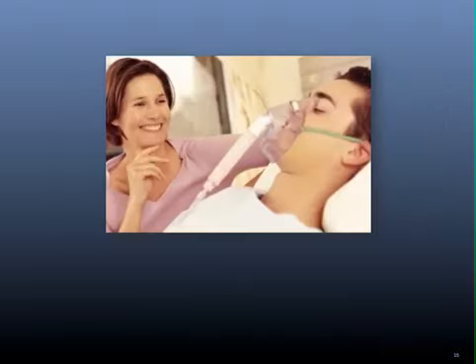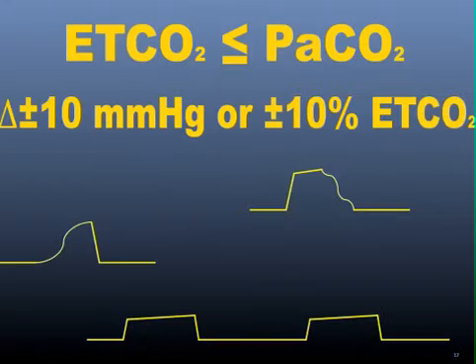One of my favorite parts about using capnography during sedation is that because you're monitoring the patient's ventilation directly and you'll know when they stop breathing, if they're going to, you can use supplemental oxygen safely. That way, if things go south during your sedation, your patient's already safely pre-oxygenated if they need to be intubated. Just make sure you're using a separate mask or a separate second nasal cannula as an oxygen supply.